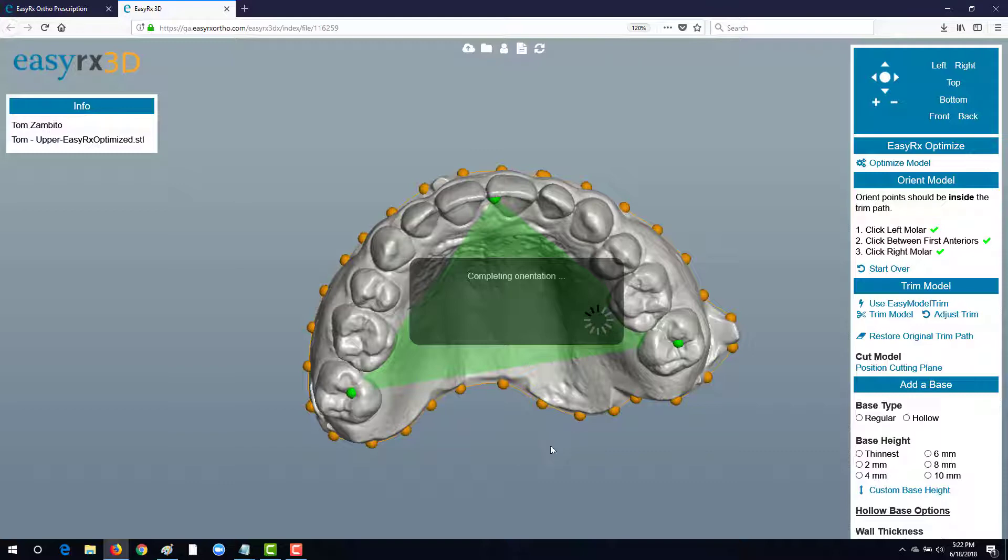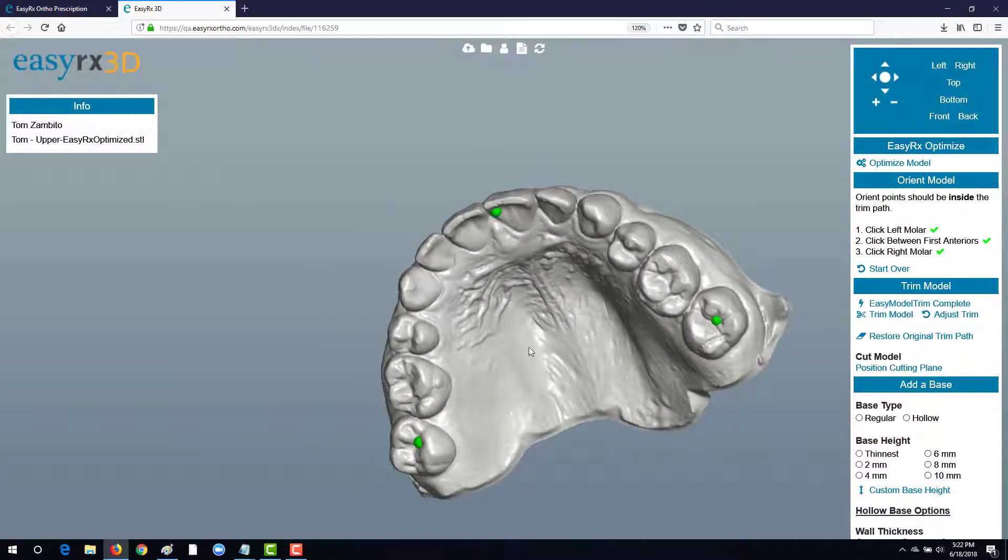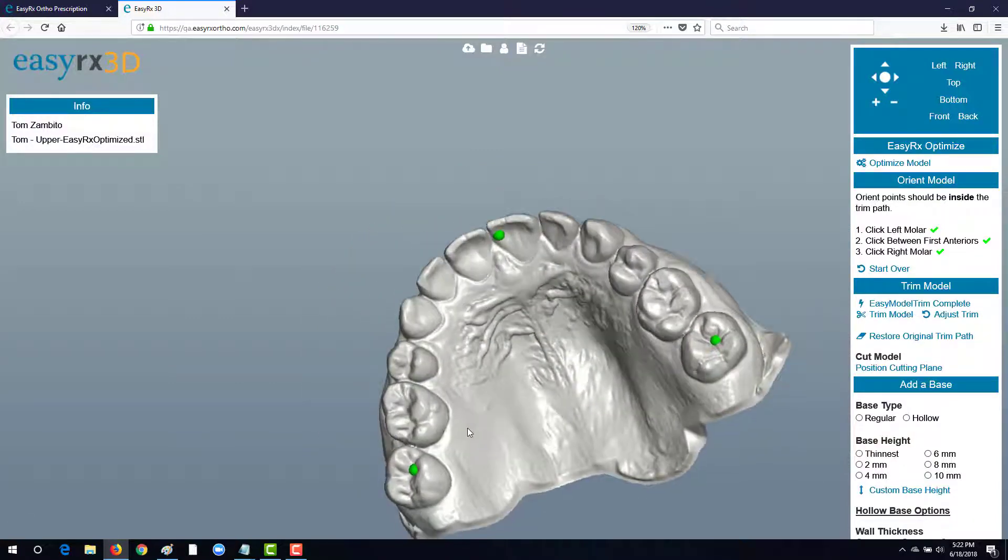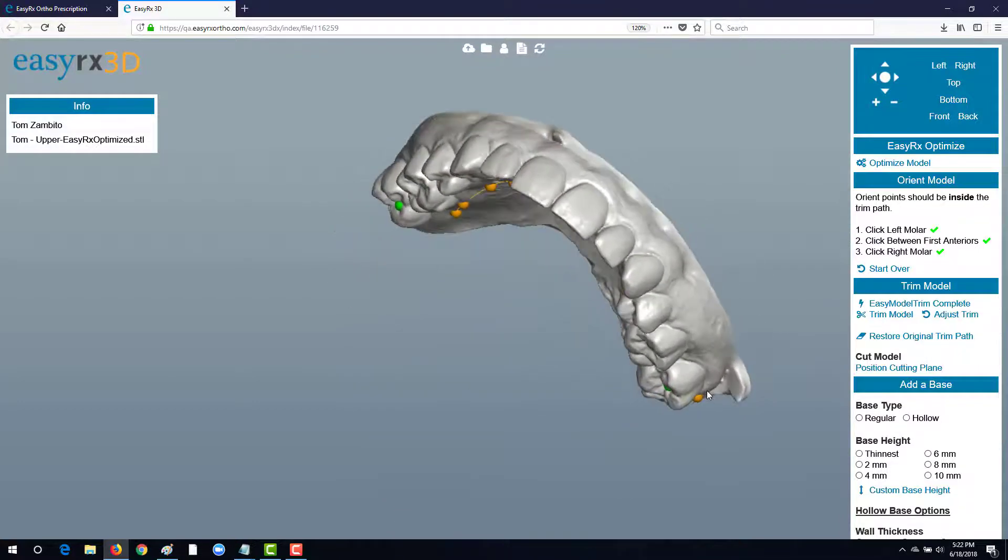Once the model is oriented, we're going to use the nifty EasyModelTrim tool to draw our own trim path. We can draw our trim path by simply selecting our left shift key and mouse and dragging it around the model. You can also trim teeth off as well should you draw around it.